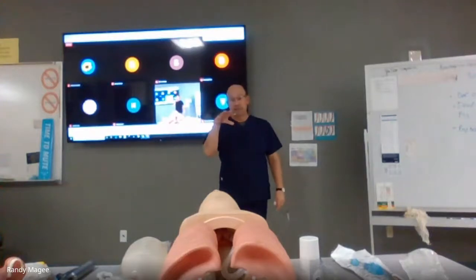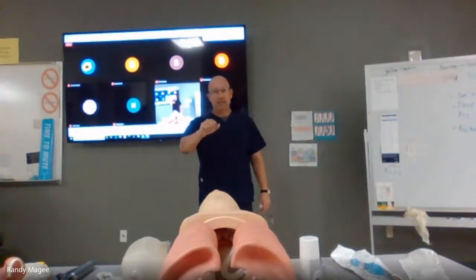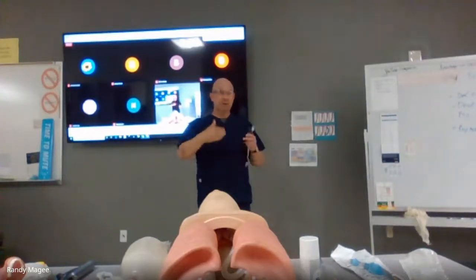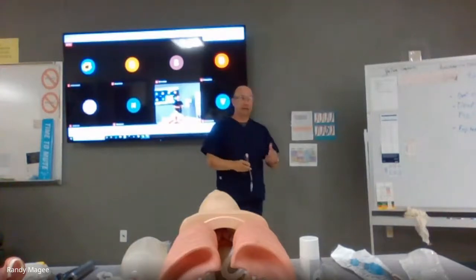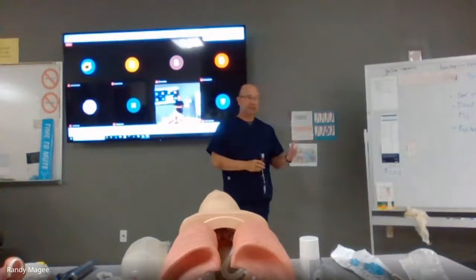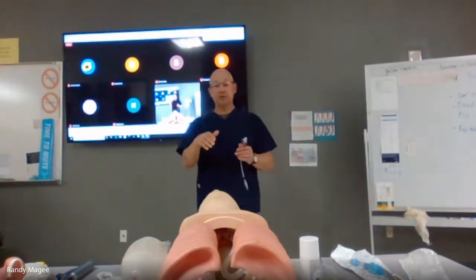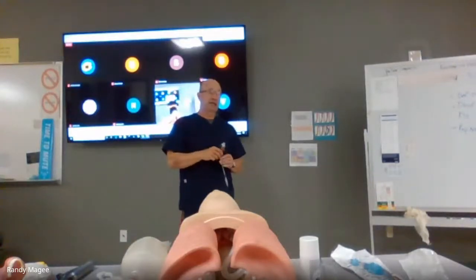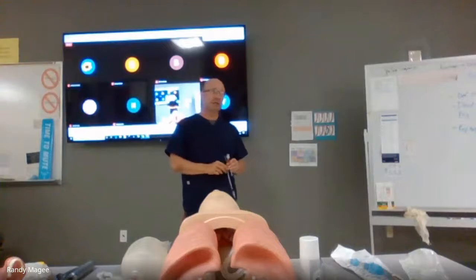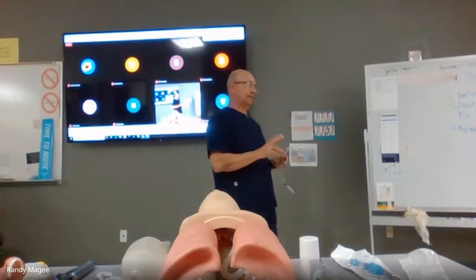The reason that we want to maybe paralyze the patient is that they're breathing and we can't get them intubated in between breaths, or they have a gag reflex. So we want to go ahead and do this. Once we sedate, I go in and look to make sure that I can see the structures and get the patient intubated. A lot of times I'll pass the tube and intubate the patient prior to giving a paralytic. There's a couple of different types of paralytics that they give.